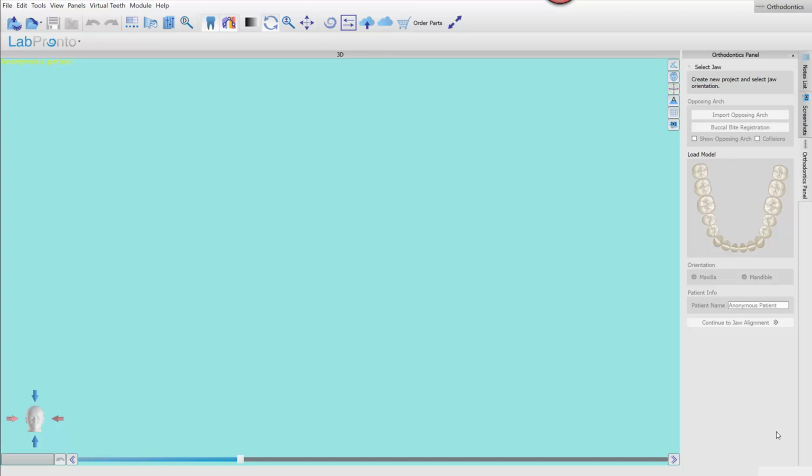This is going to be just a short video series focused on delegation. I've made a series in the past on guided surgery, with the intent of showing you which tasks should be set up for the doctor or the designer ahead of time to help refine the process, or I should say increase the efficiency.